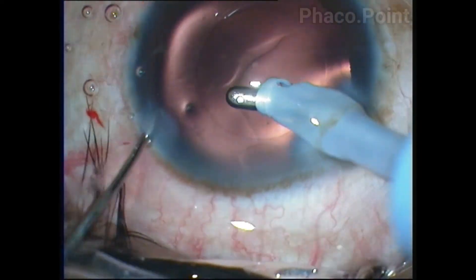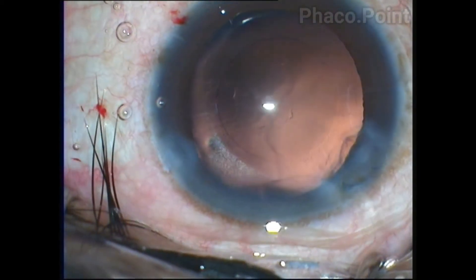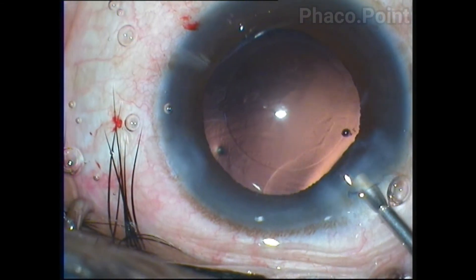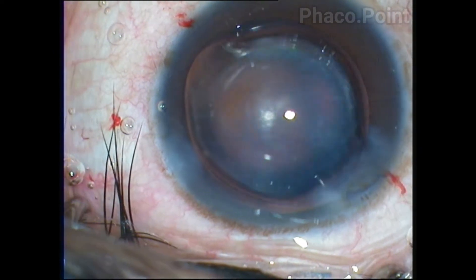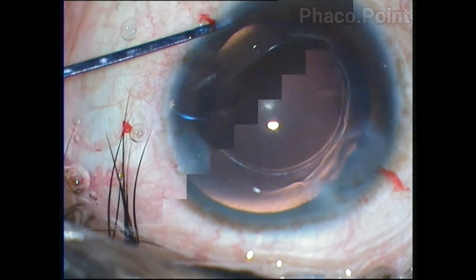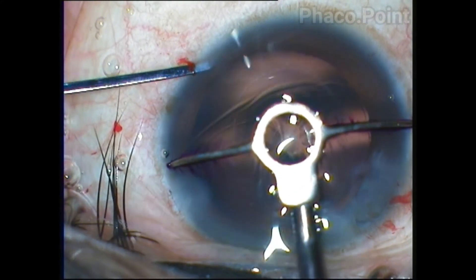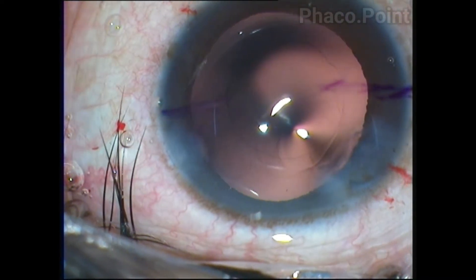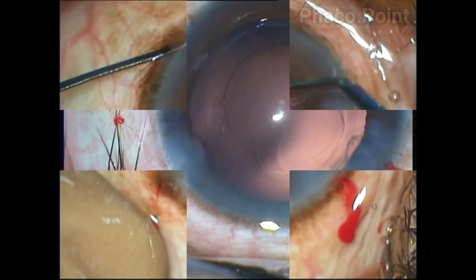At this point I tend to enhance the visibility of these axis of placement marks by adding a little amount of blue dye. The reason I do this is because while you are focused on the cornea these marks are visible, but when you are focused on the IOL plane these marks may not be visible. A little amount of blue dye is achieved by rubbing the marker pen onto the back of an instrument and gently pressing it — the blue dye will go and stain only the groove of these marks that you made — then you wash it off.